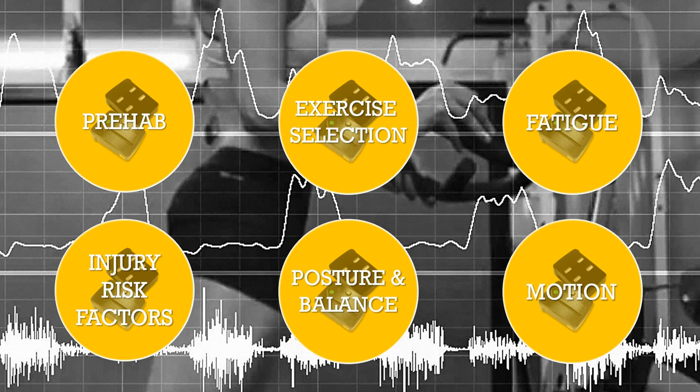But again, the benefit of electromyography is that you are assessing the origin of that movement, the individual muscles that are contributing to that movement pattern. And that's a crucial component of understanding human movement, because it completes the picture, if that makes sense, of what's actually going on here, what's causing this movement to occur. And without it, we would never really have a full understanding of human movement. So it's an important technique.